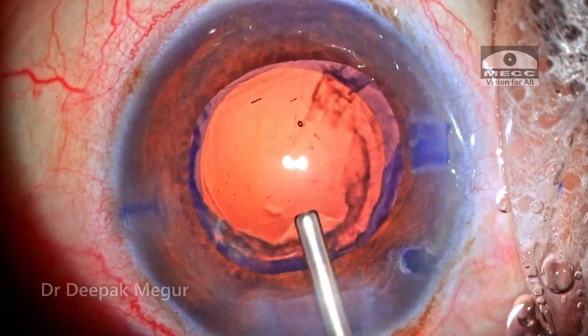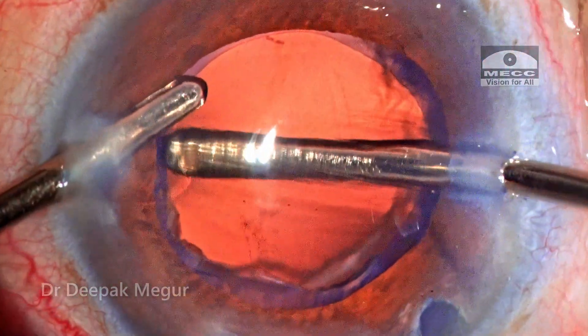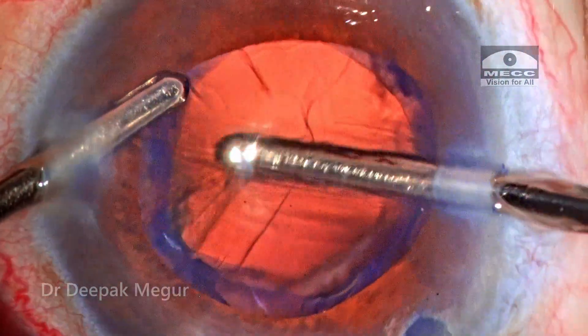Time to aspirate the cortex. Manual irrigation-aspiration is used to aspirate all the cortex.